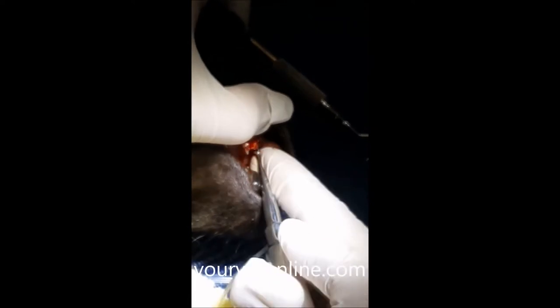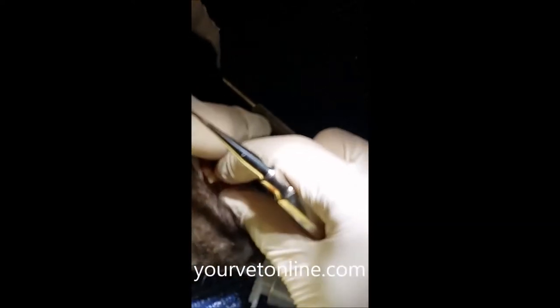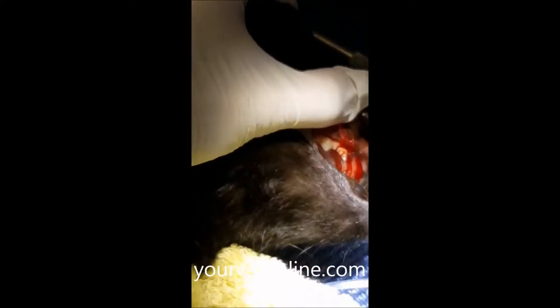There we go — it's nearly ready to come out. And there we go, we can remove that one root of that tooth.